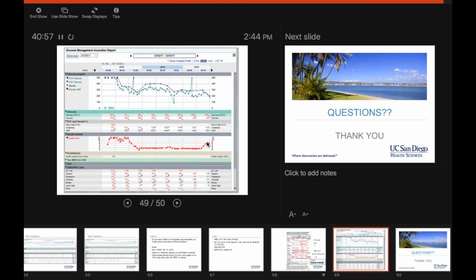Is to get them to like normal. Yeah. Within goal. So then you can turn off your dextrose. You can uncheck that box and let the calculator do its thing. Okay? And it'll tell you then what their basal rate is that they actually require to then facilitate a proper transition to sub-Q insulin. Make sense? Which is really nice, especially if it's in the middle of the night. If you turn that dextrose off, then you would also have to hit that yes. Absolutely. Absolutely.